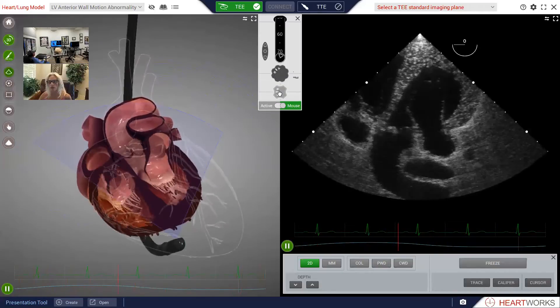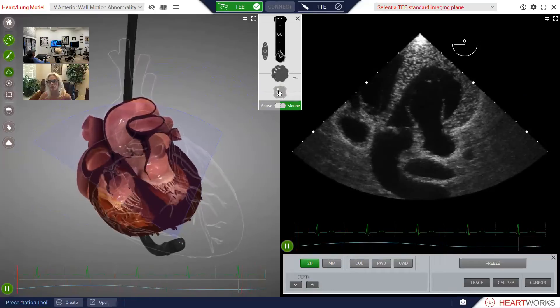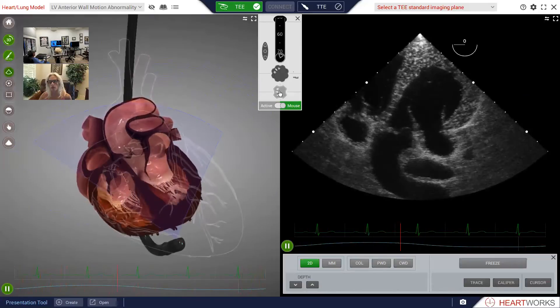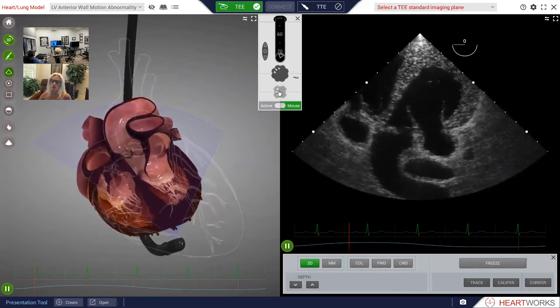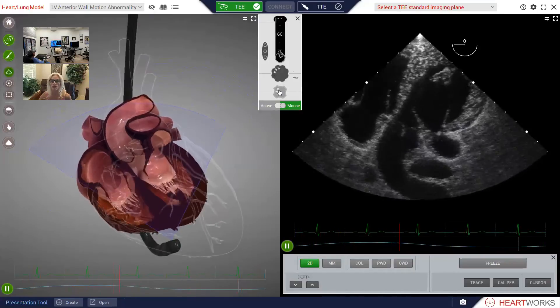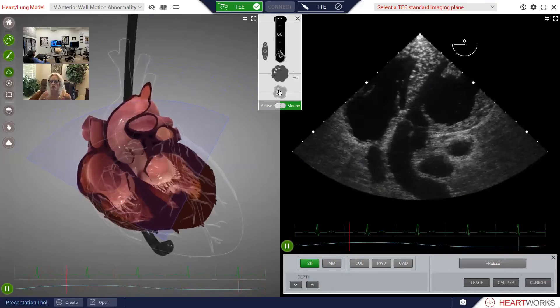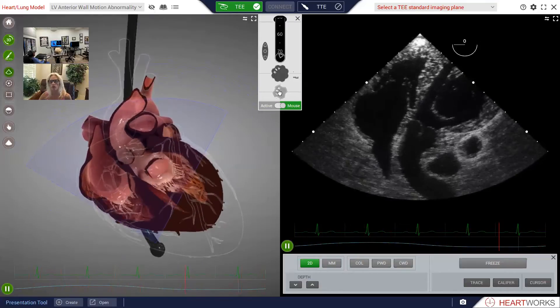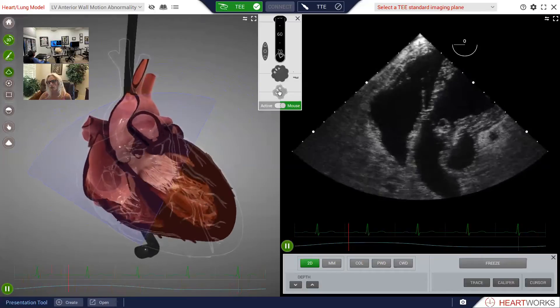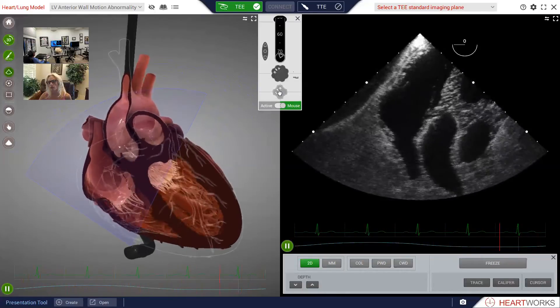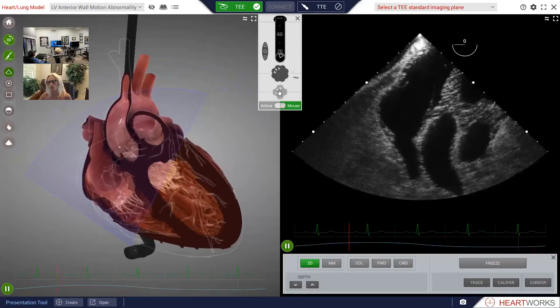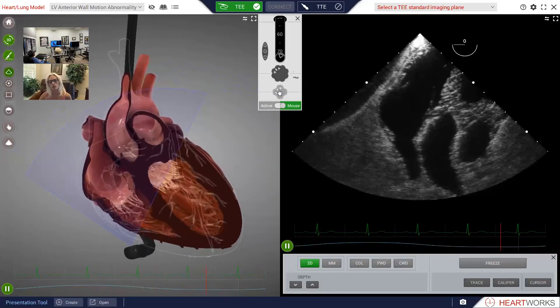If we could use a negative omniplane, we could use that, but unfortunately most machines won't do negative omniplane. So as an alternative, we can use a right flexion using the lateral right flexion with the small wheel. Go ahead and start dialing in some right flexion — it'll take pretty strong right flexion. As you do that, you'll start to see the RVOT and the pulmonic valve in the right side of the sector. There's the pulmonic valve. Go ahead and dial in all the right lateral flexion that you can.